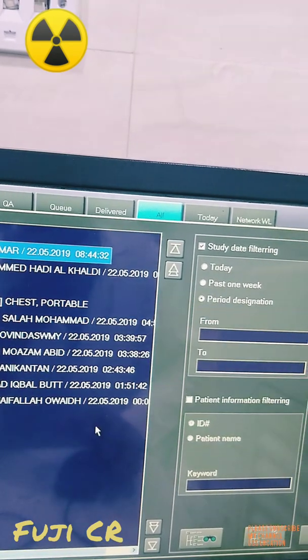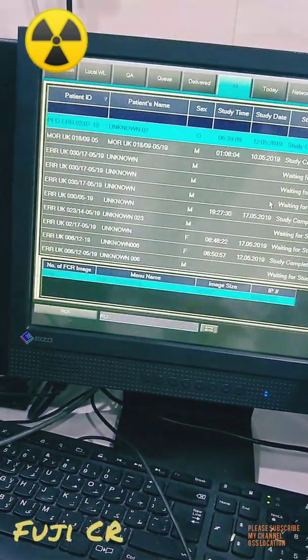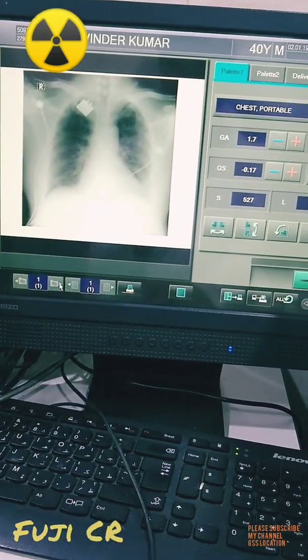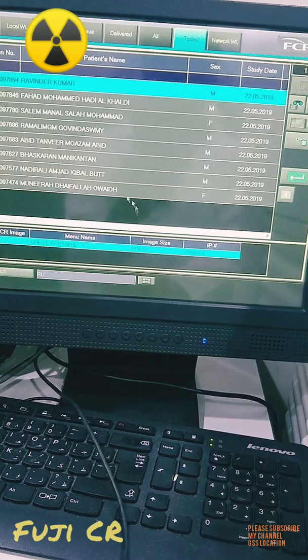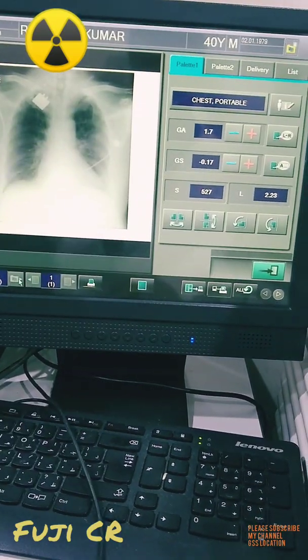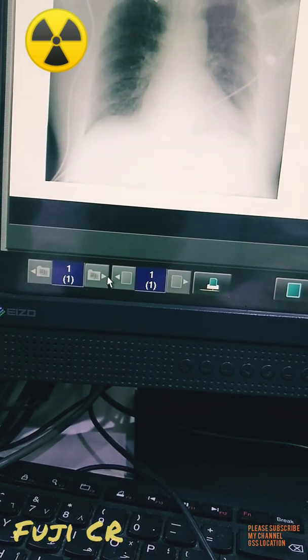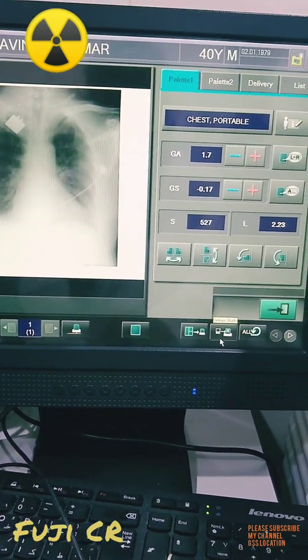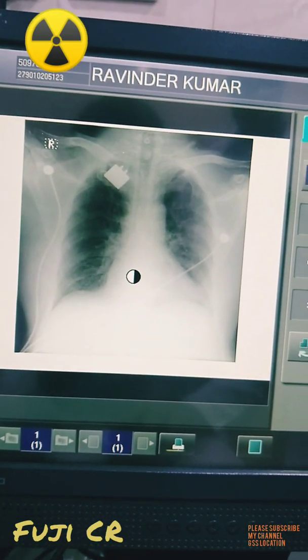Click OK and it will transfer — it is a simple process. I had doubts about this before, so I am making this video to help our technicians. After the transfer, open the correct patient and you will see the second image inside. Click that second image and push it to fax. If you are not using fax, just print it — you will get all the corrected patient data.